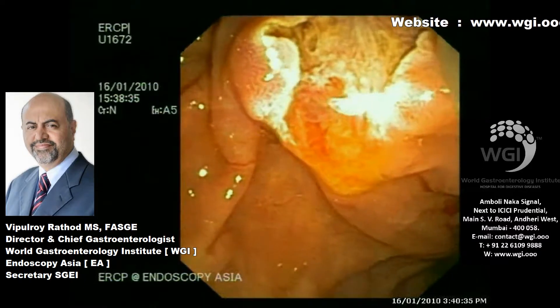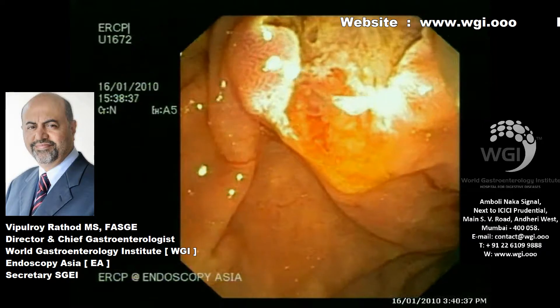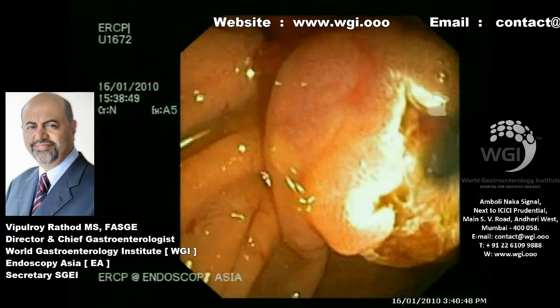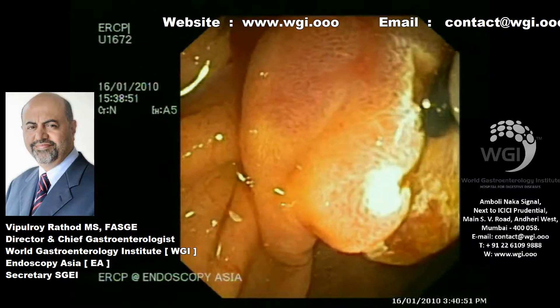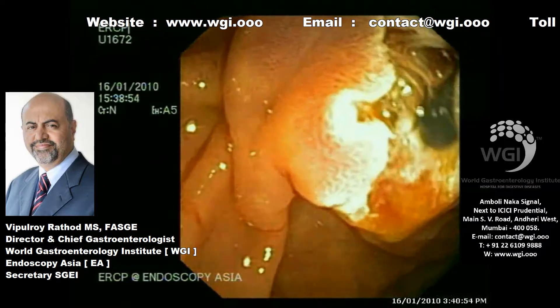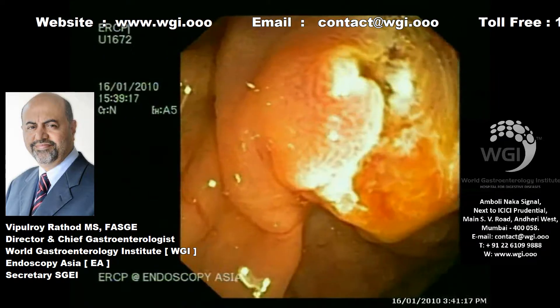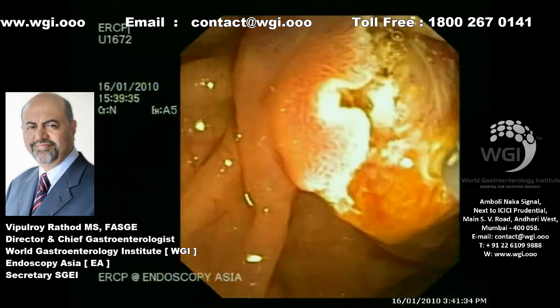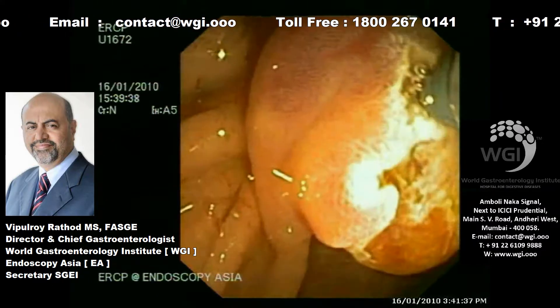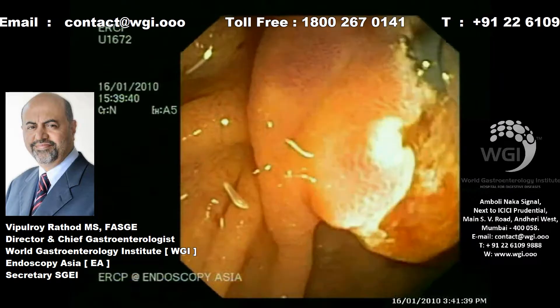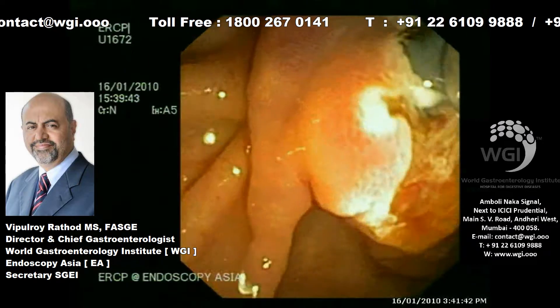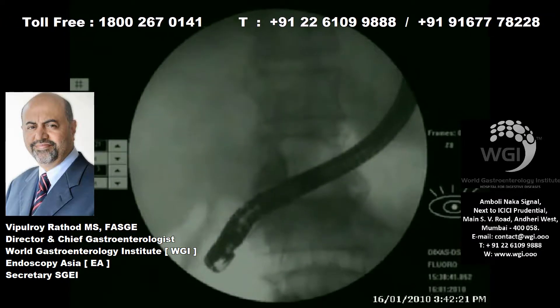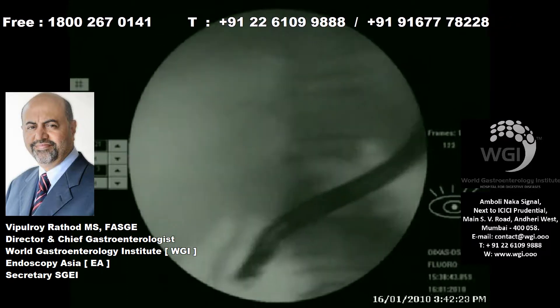Once we have done this with a conventional sphincterotome, I can see some opening and some bulges there. Very gently, we take a needle knife sphincterotome and peel the onion of the ampulla — very gentle maneuvers, a very gentle cut. Then I am using a specially designed biliary dilator, a 7 French taper tip with a Terumo wire, because sometimes these tumors are extremely tight and very sclerotic to negotiate.